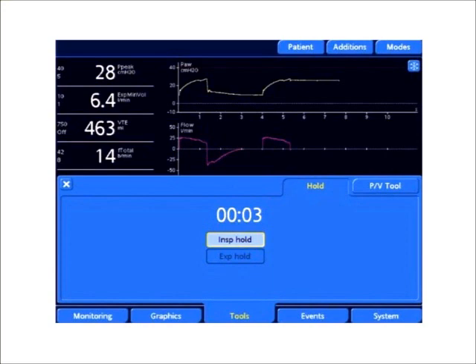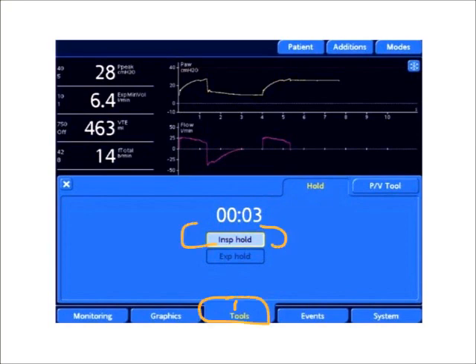What we're looking at is a screenshot from a Hamilton G5 ventilator, and we are performing an inspiratory hold maneuver. The tab came up, I selected Tools, and under Tools, I'm allowed to do an inspiratory hold.